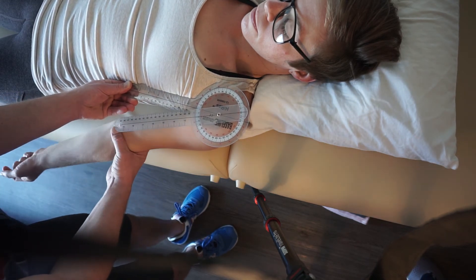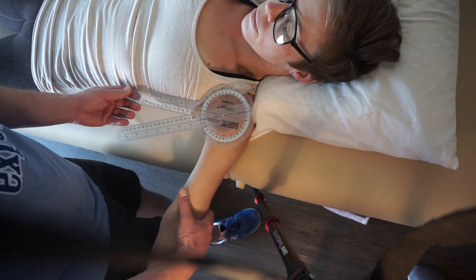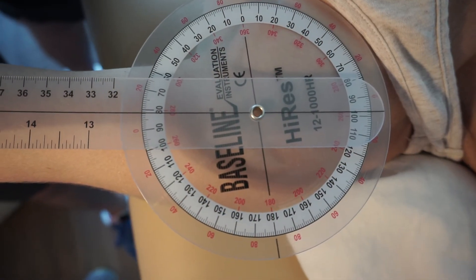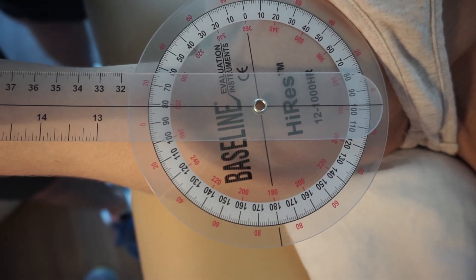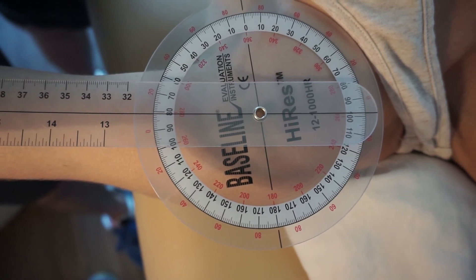I'm going to support the arm and have her abduct as far as she can. After the movement, I can remove everything, and with the marker already placed it's easy to find the fulcrum spot. Actively, she has 82 degrees of active shoulder abduction.